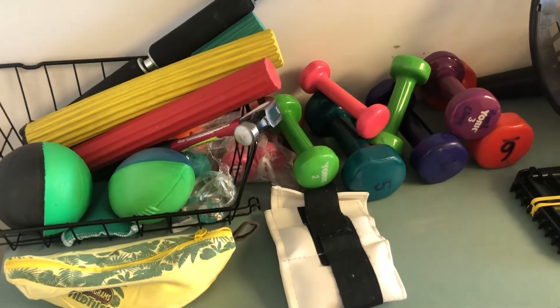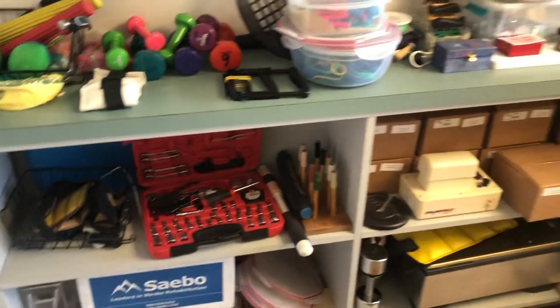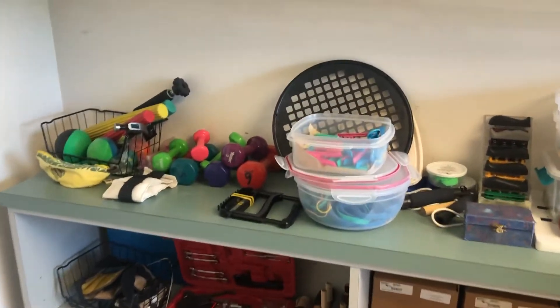Welcome to Outpatient Hand Therapy. Here are all the tools and gadgets and gizmos used for treatment in hand therapy.